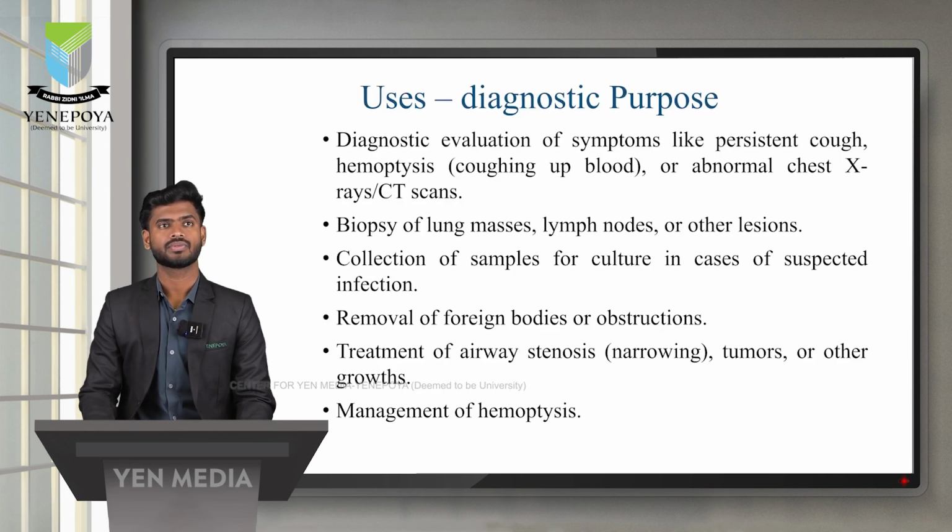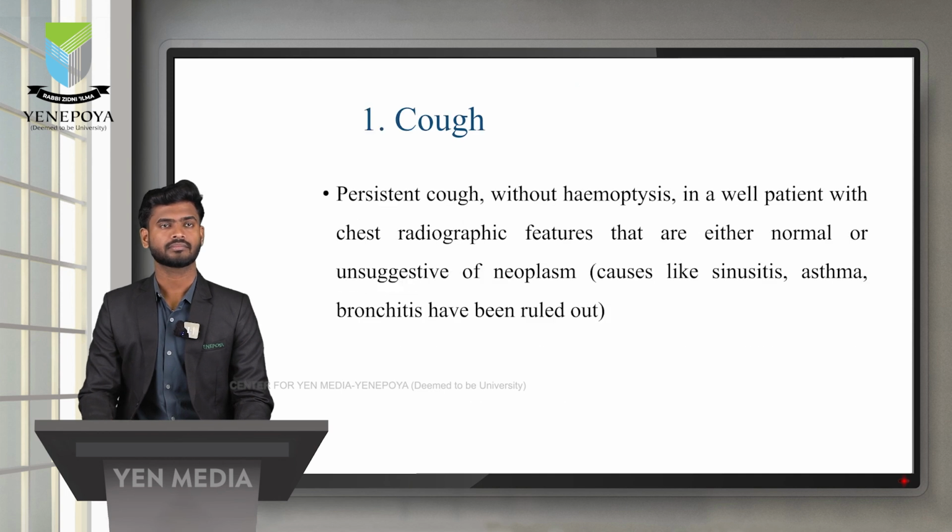Okay, now we come to uses. Diagnostic purpose: diagnostic evaluation of symptoms like a persistent cough, hemoptysis, or abnormal chest x-rays; biopsies of lung masses, lymph nodes, or other lesions; collection of a sample for culture in cases of suspected infections; removal of foreign bodies or obstructions; treatment of airway stenosis, tumor or other growth; management of hemoptysis.